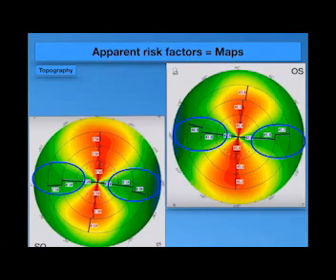So if you look at the maps shown in this slide, you will see that the vertical meridian is the steepest meridian, and the points pointed in red from the superior part. The figures are 43 and the highest point, and in the central 6 millimeter, you will find that there is 45.1 in the superior point.